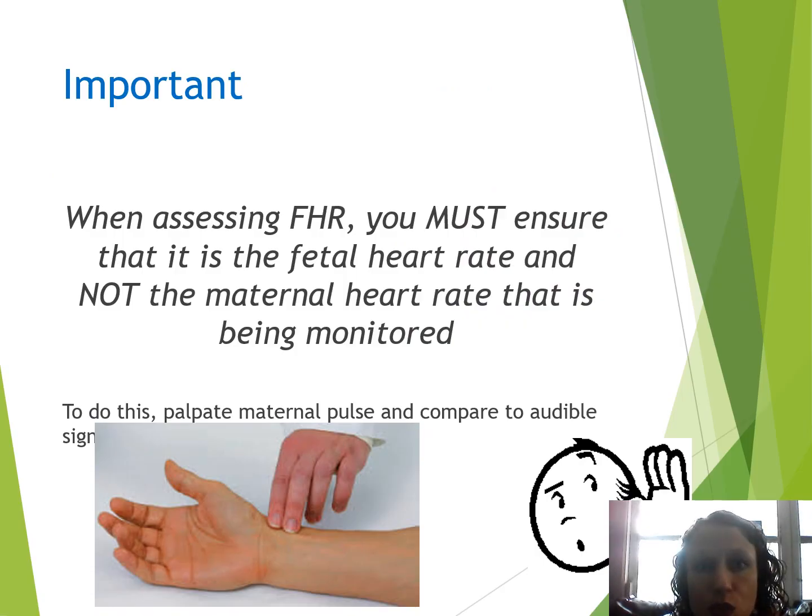One thing that's really important for us to know when we are assessing baby's heart rate is that we also need to know what mom's heart rate is. It is actually easier than you would think to get those mixed up. So it's really important to know what mom's heart rate is when we're looking at baby's heart rate.